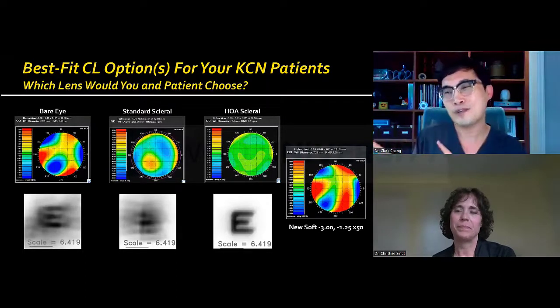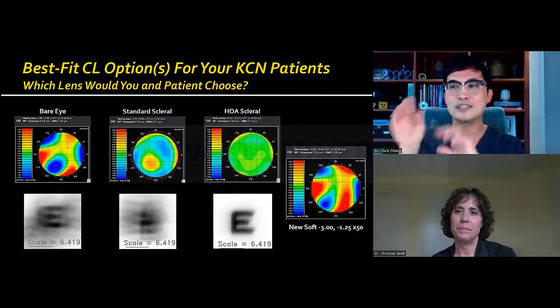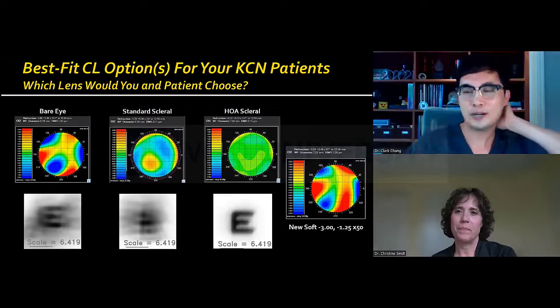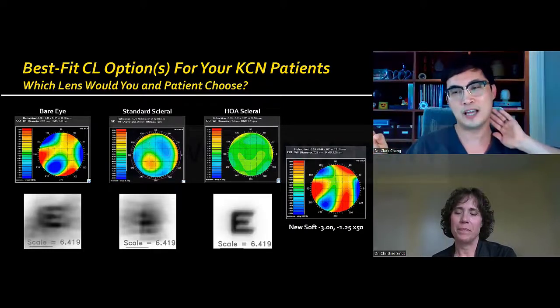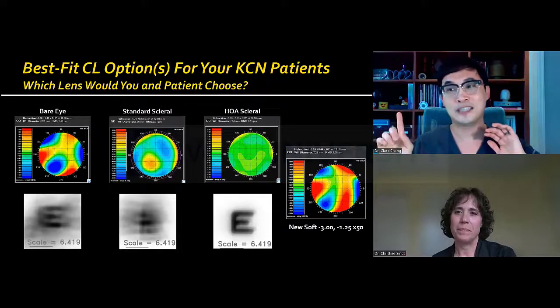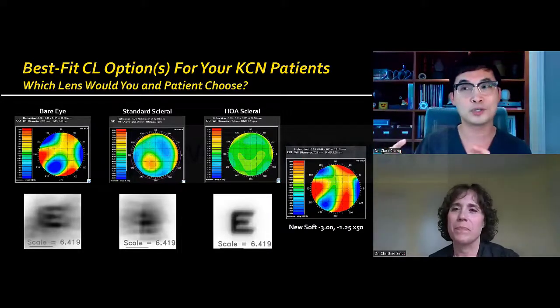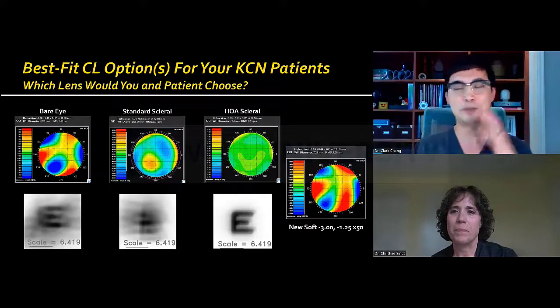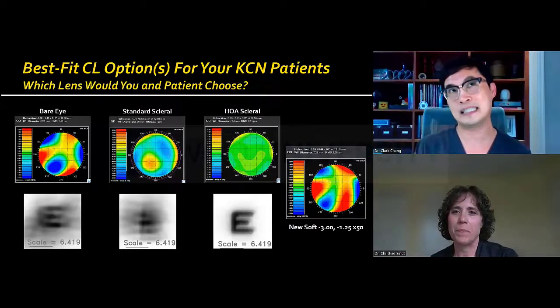So I always tell them, for that first lens, at least give me a chance. Go home and try it. Let's make sure you can wear the lens before we decide how to redistribute the correction of the HOA, knowing we're not going to go down to 0, because 0 is not good for these patients either. They've neuroadapted to some blur. They don't really want to let that go. So for her, the very last lens, she put it on at dispensing and said, oh, it's still very blurry. I really can't tell. It's still 20/400.